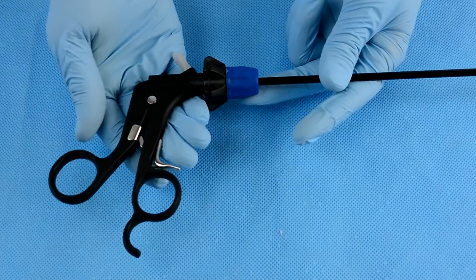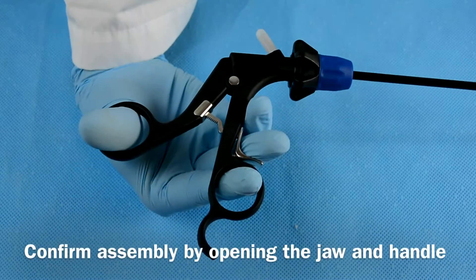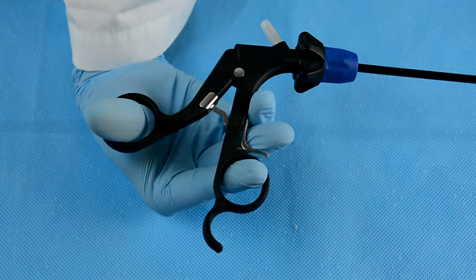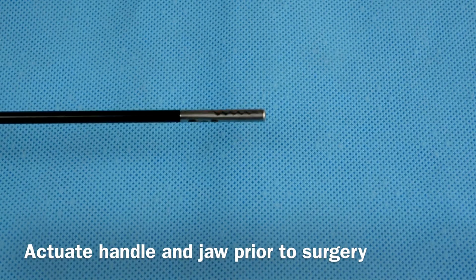Thread the rotator cap tightly clockwise and confirm assembly by opening and closing the jaw with the handle. Lastly, make sure to actuate the handle and the jaw prior to surgery.